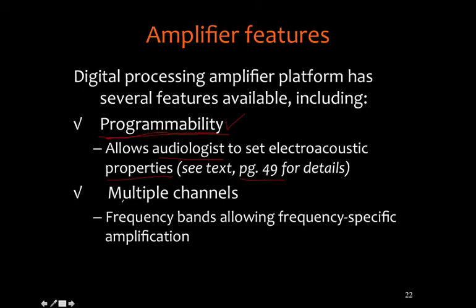Another feature of digital processors is that the signal that I'm programming, the frequency spectrum that I'm working on, I can chop it up into multiple channels. It's not infinitesimal in terms of our capacity.